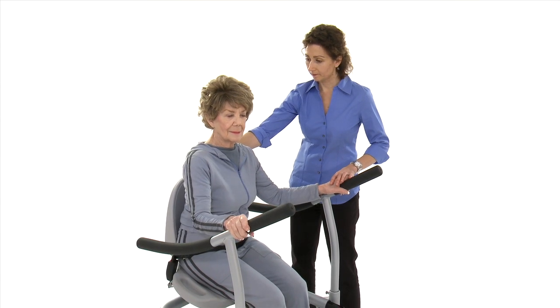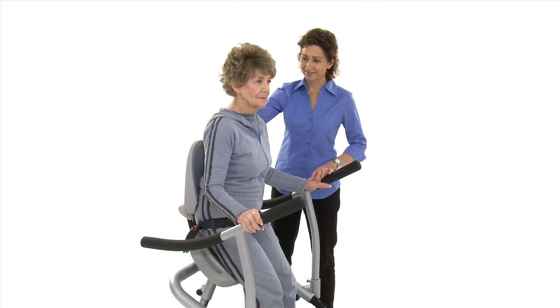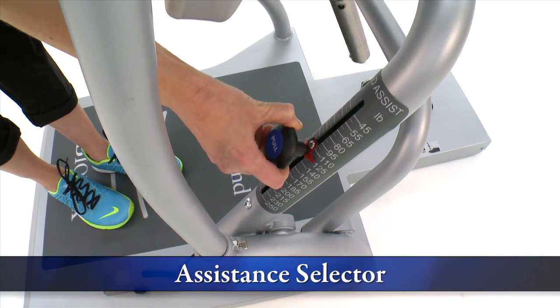To accommodate the needs of both strength and wellness, the sit-to-stand offers several distinct features. The assistance selector allows the user to set the amount of assistance that's right for them.